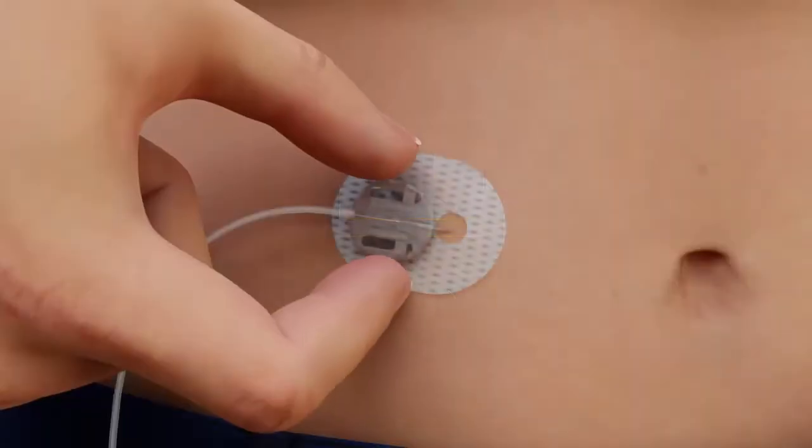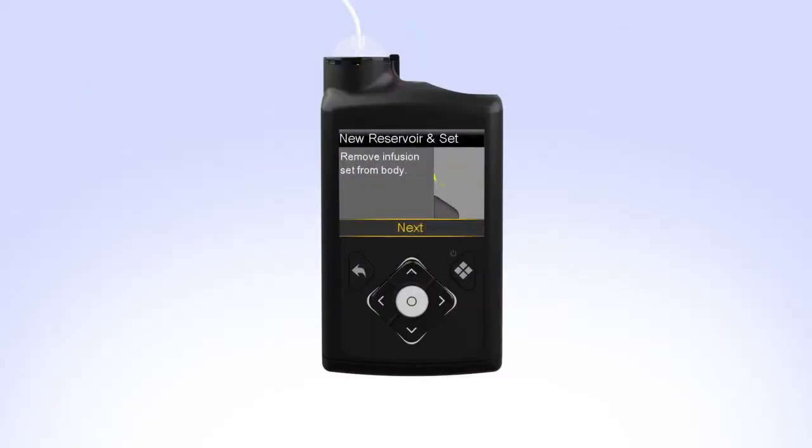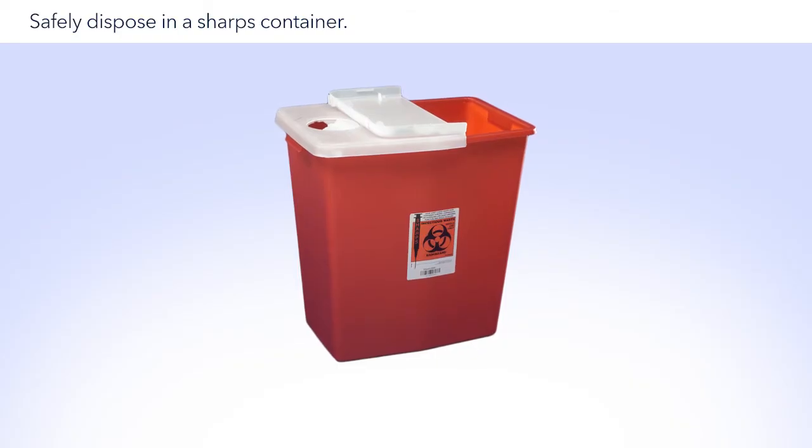Remove the infusion set you are currently wearing from your body. Pick up your pump and select Next. Then remove the reservoir from your pump by turning the tubing connector counterclockwise. Safely dispose of the used infusion set and reservoir.